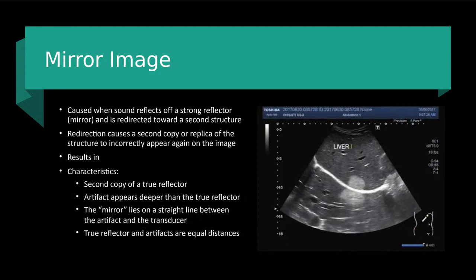If we look at our example here, we have our liver and we have that liver capsule, right? We have that edge of the liver, and that's a really strong, dense, fibrous tissue. So that's why it's going to appear more hyperechoic in that region, right? Because it's protecting all of that tissue. So when we have this mass that's located really close to that strong reflector here, it's going to create a mirror image on the opposite side of it. This is the first thing that's going to draw our eye to this image. But if you also look, it's actually reflecting more of that liver tissue on the opposite side as well.